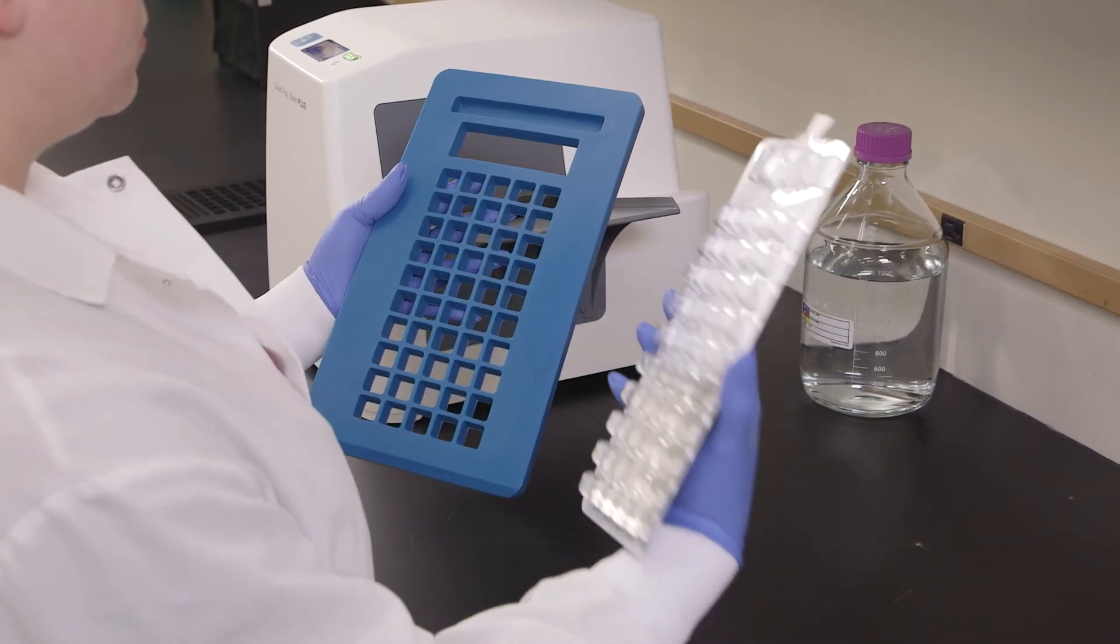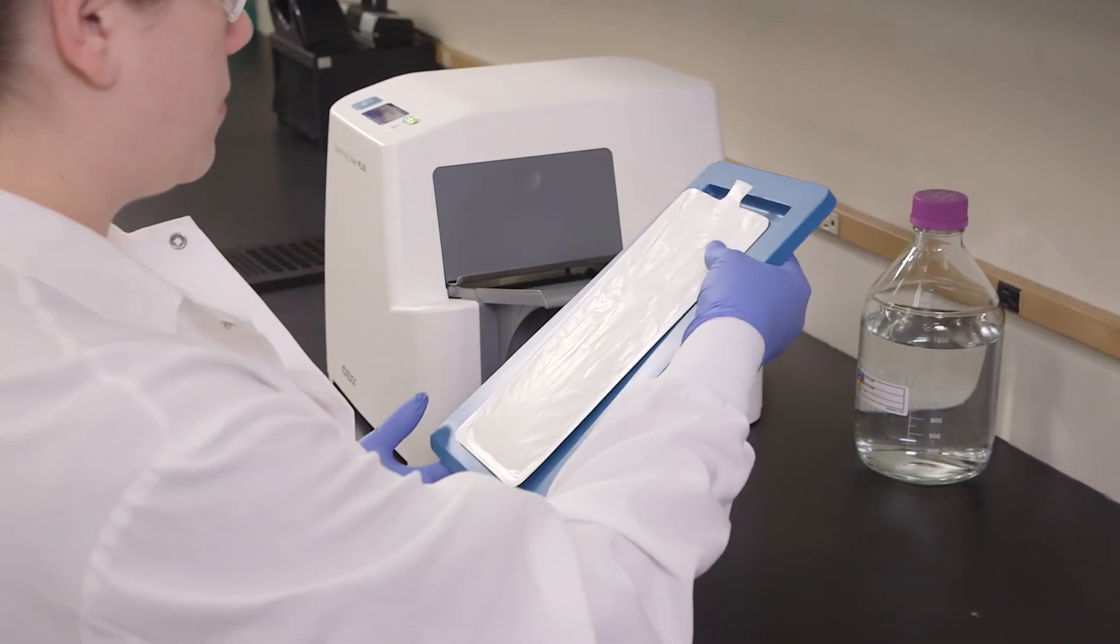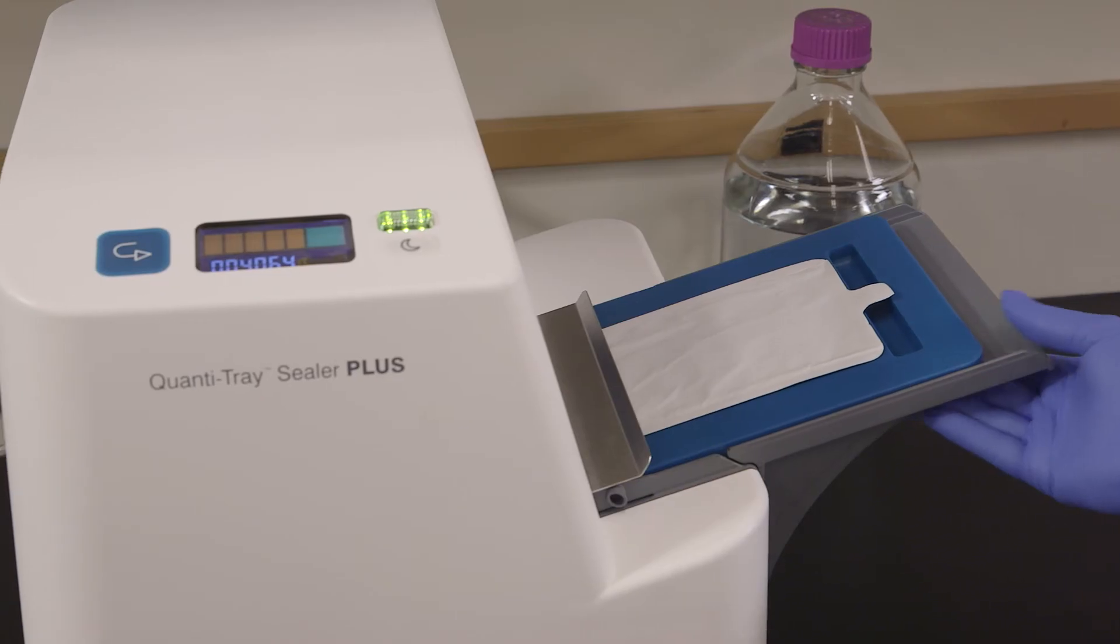Place the filled Quantitray on the rubber insert making sure each well fits its corresponding hole. Push the insert with the tray into the sealer until the sealer grabs the tray and pulls it into the slot.